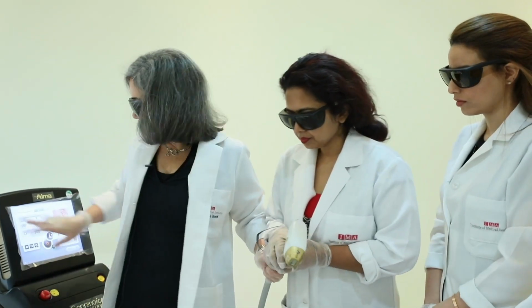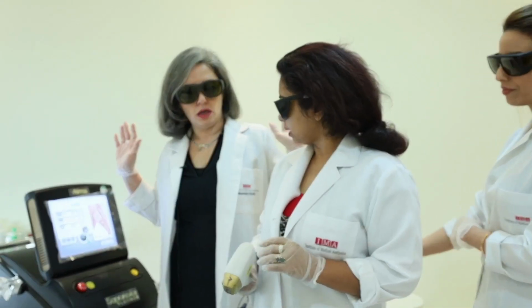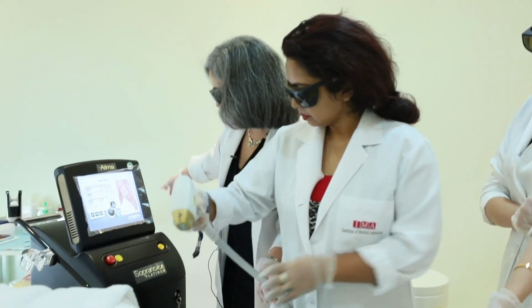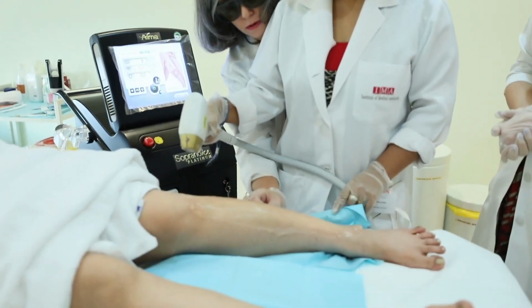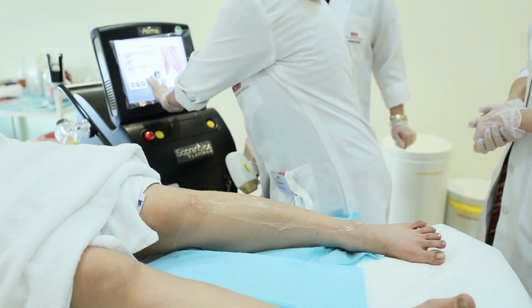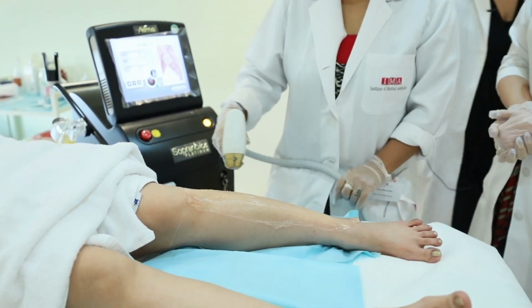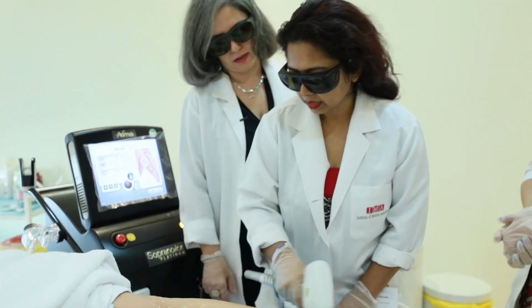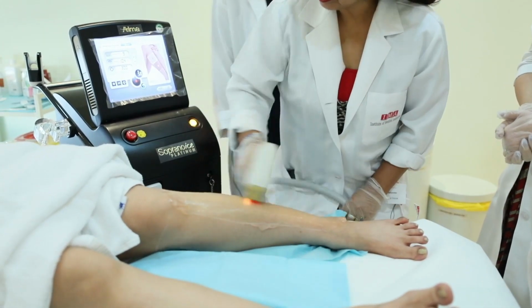Start one by one. When I want to hand the laser to somebody else, stand by. Again, once you are ready, everything is ready. Hold the weight with your other hand so it will not pull you. Yeah. Everything is fine. Remove this one. Then you can now yourself put the laser on ready. Laser is ready. Yeah. So first I go with the motion and then start? Yeah, exactly. Bravo. Full contact. Very good. Are you okay, ma'am? Yes.